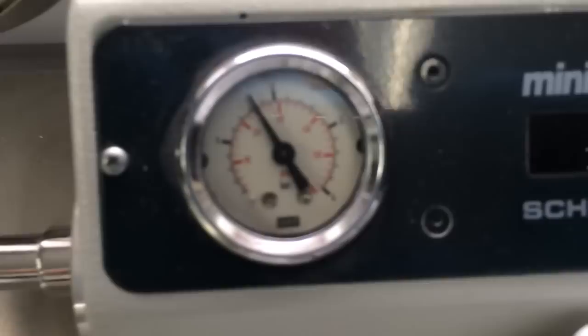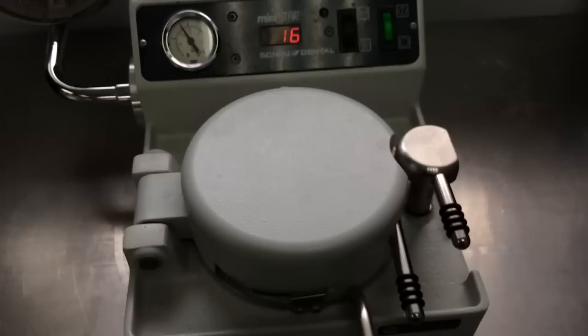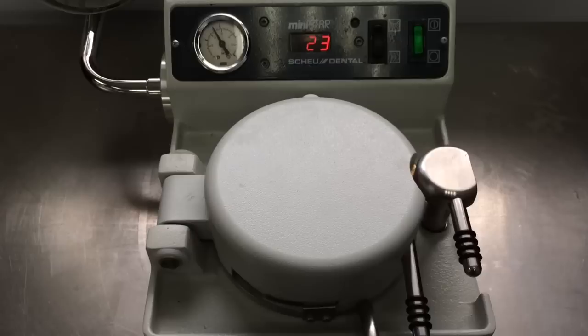it's putting about 25 pounds per square inch of pressure on the mouth guard blank that's inside there. And what that's doing is that's forcing all of that softened material all around the model. And so that's what forms it around the teeth.